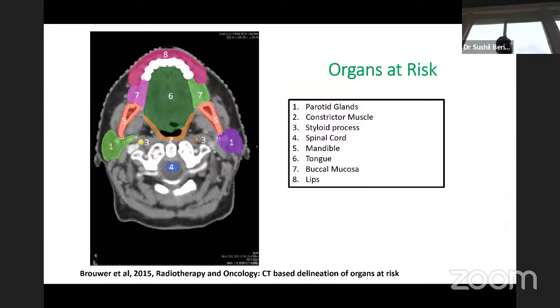The 2D approach, which was shown by Dr. Suman, in that era, the spinal cord routinely used to get 50 gray and above because we ignored the contribution for the electron beam. But that was done in the era when chemotherapy was not done. In the chemoradiation era, people are more conservative and they try to limit the dose to 45 gray or so. But in true sense, there is no difference in spinal cord complication anywhere between 40 to 50 gray.